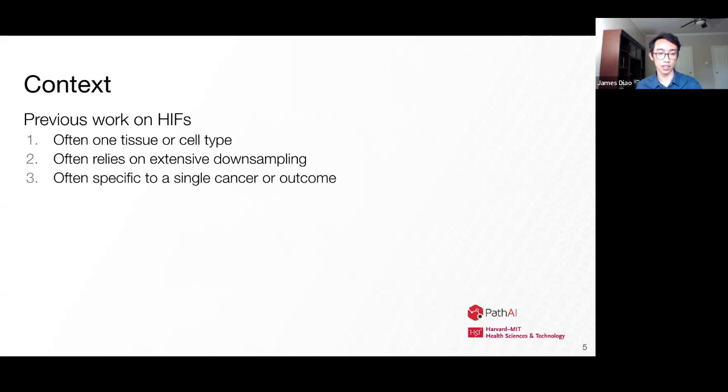And we saw the most common by far was lung adenocarcinoma or lung squamous cell carcinoma, partially owing just to the really large number of samples in the public domain relative to a lot of other cancer types. And then the easy accessibility of certain outcomes like progression-free survival, for example, as another target that was often predicted, but usually it was just one rather than multiple things.